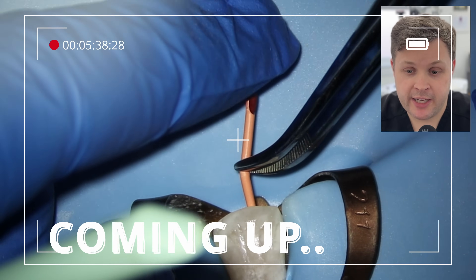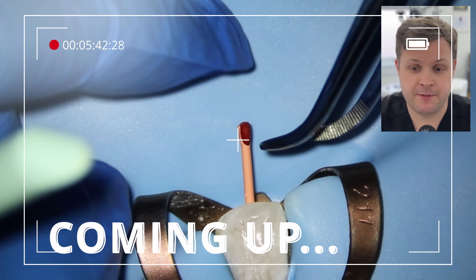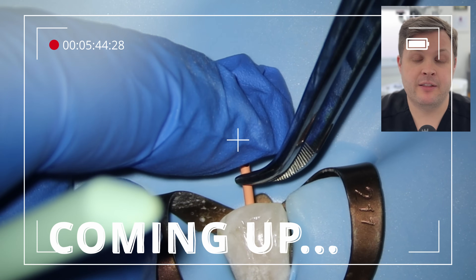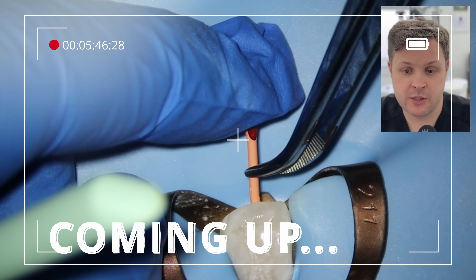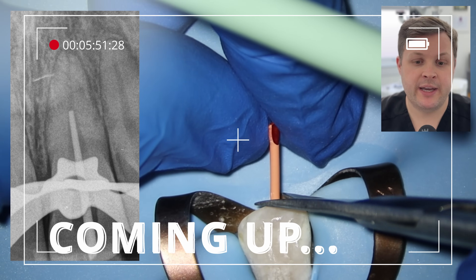What I want to do is I'm going to check this with our radiograph. In this case, I'm going to take a GP cone, cut it to 50, and then place it at the point where we're getting zero on our apex locator. And we can see here on our x-ray that it is way, way too short.